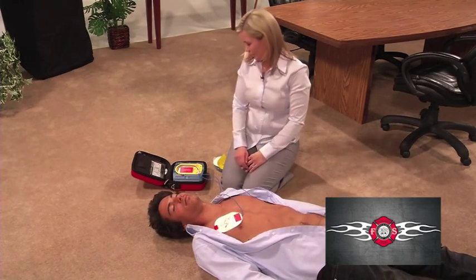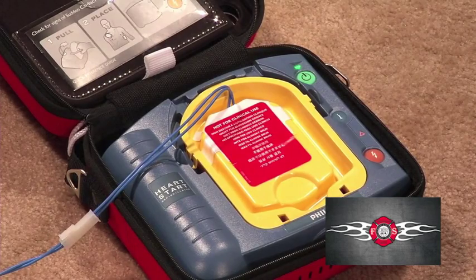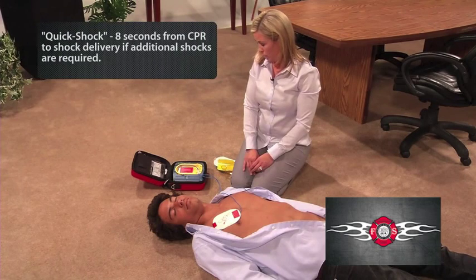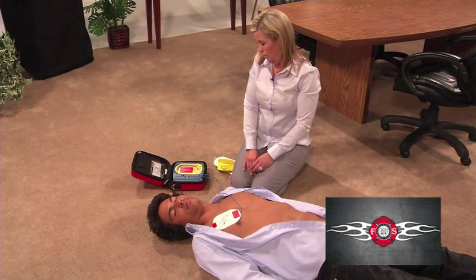Stop CPR — no one should touch the patient. The AED is analyzing. Keep standing clear of the patient while the AED is evaluating. It may decide to shock again, or it may say shock not advised.